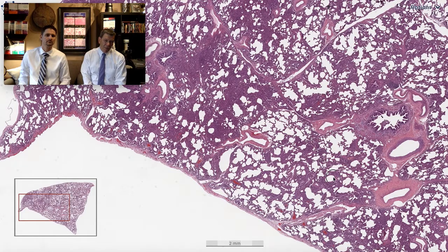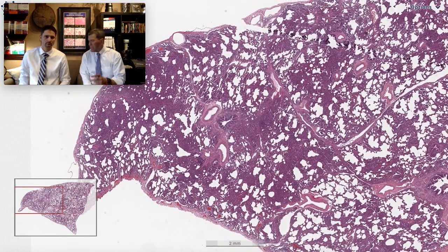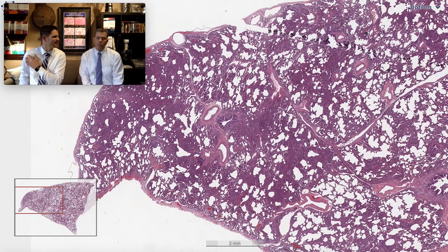The other thing we've got to think about is hypersensitivity, especially since the cellular infiltrates seem to be gathering around the airways — and that's where you get inhalation. A chronic inhalational etiology. So maybe we should look around the airways and see if we see any granulomas. If you're going to look for granulomas in hypersensitivity, they're going to be in the vicinity of the — oh my God — right there.